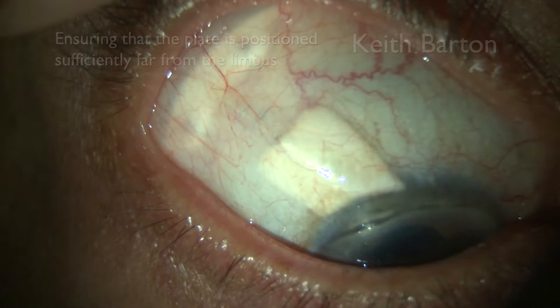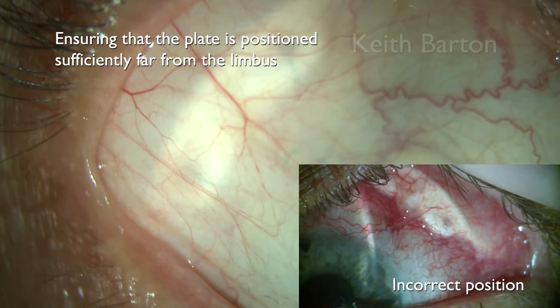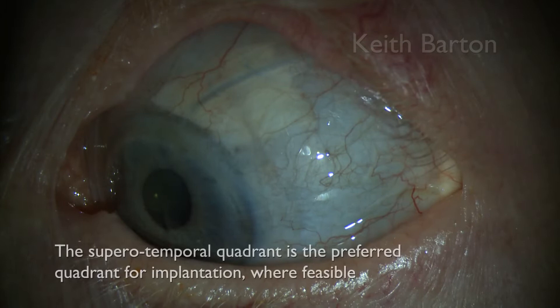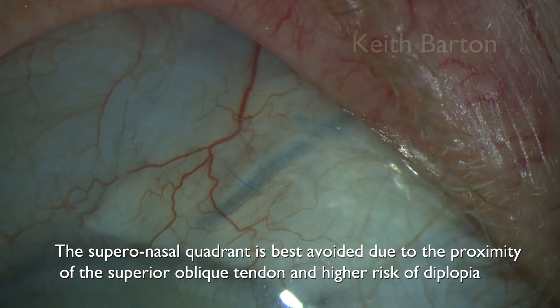This is the correct position of the plate — around 10mm from the limbus — and in the smaller box is the incorrect position, far too close to the limbus. The supratemporal quadrant is the preferred quadrant for implantation where feasible. Supranasal is best avoided due to the proximity of the superior oblique tendon and a higher risk of diplopia.